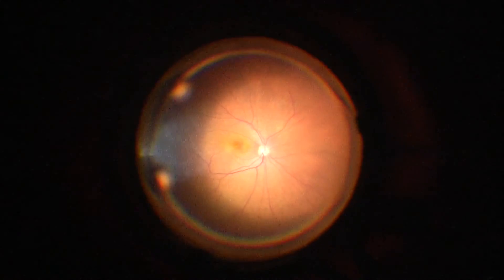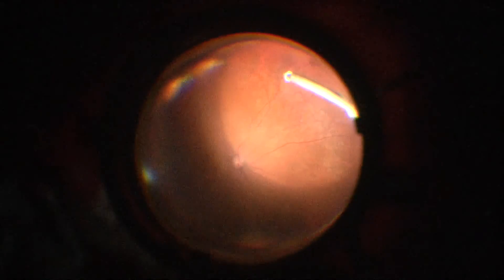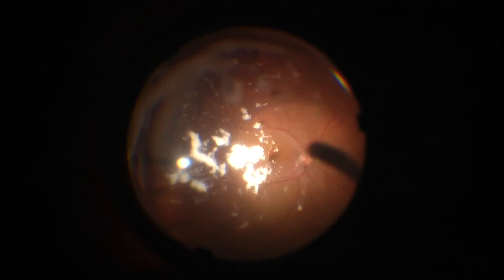The vitrectomy is performed and care is taken to identify that the posterior hyaloid is elevated. We use intravitreal triamcinolone particles to identify vitreous and remove the posterior hyaloid.